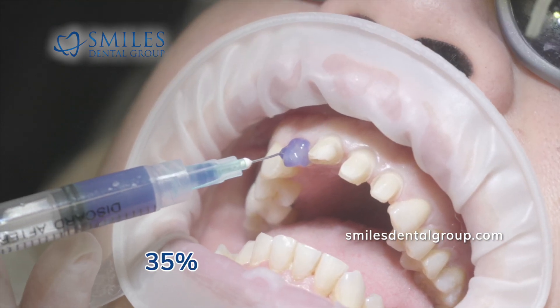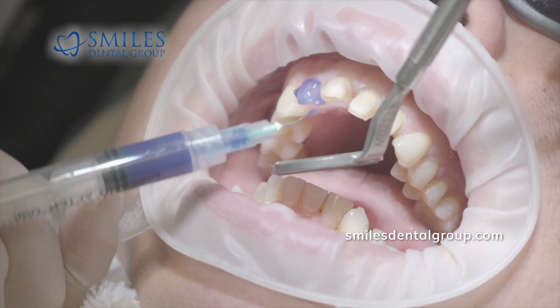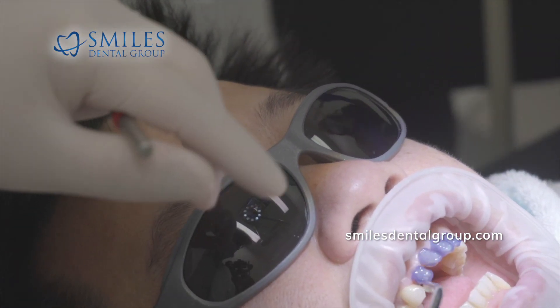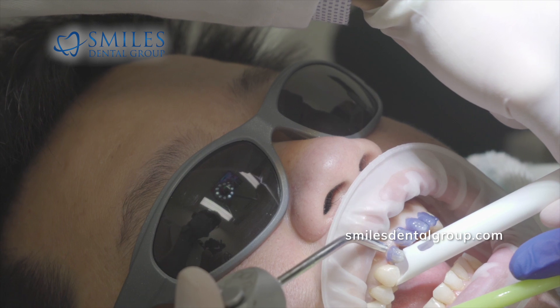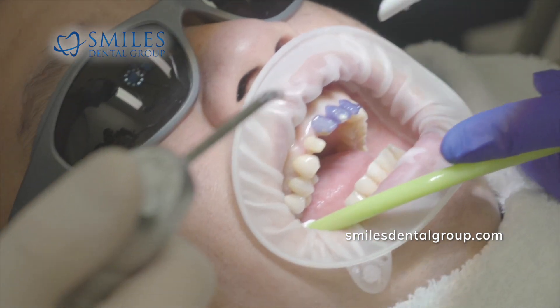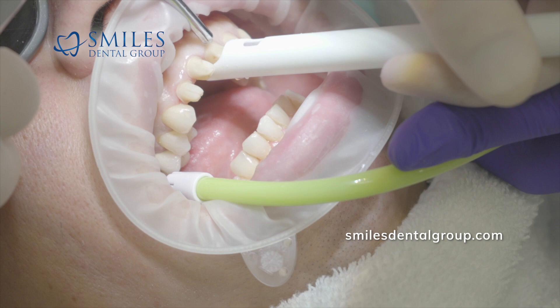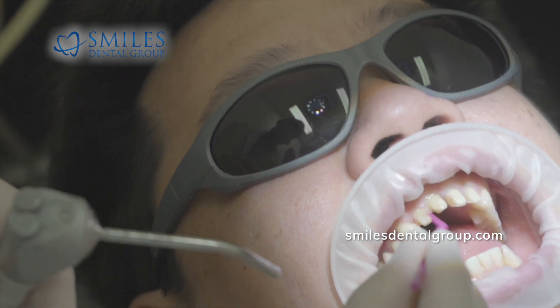The blue etch is the typical etch we use for all resin bonded restorations, whether they be fillings or porcelain restorations with resin cements. We're careful not to get any of the etch onto the gingiva. Because it is a fairly strong acid etch, we're very careful not to get any on the patient's soft tissue — lips, tongue, cheek, or anything like that. Careful use of the air-water syringe and high volume suction is very important.